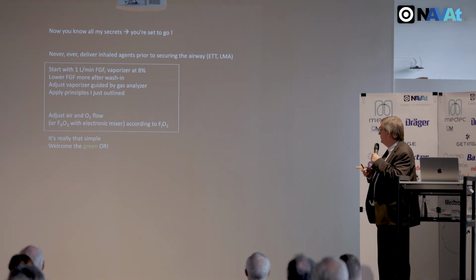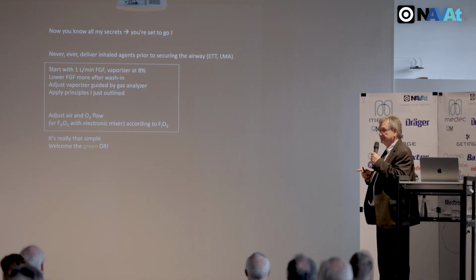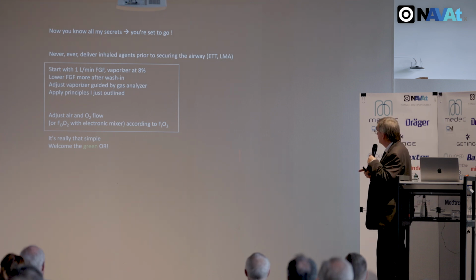Never, ever deliver inhaled anesthetic agent prior to securing the airway. It's pure waste. If you do anything, just give some additional propofol. Never, ever give inhaled anesthetic prior to securing the airway.